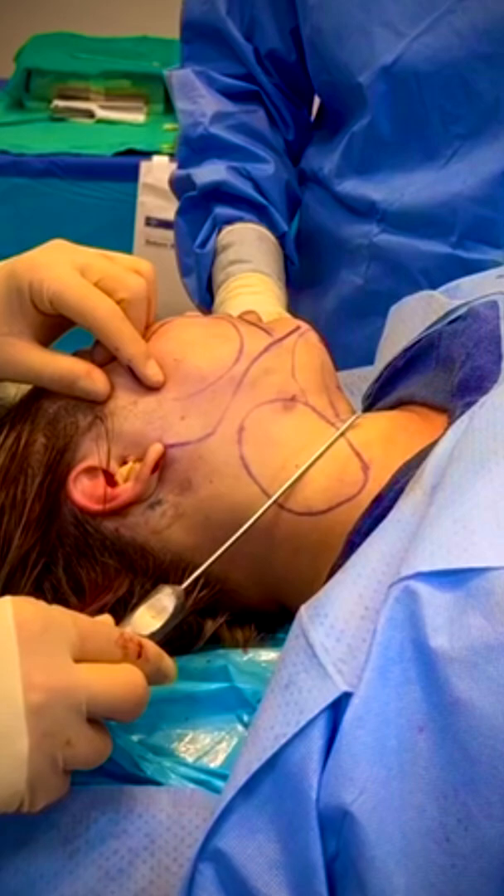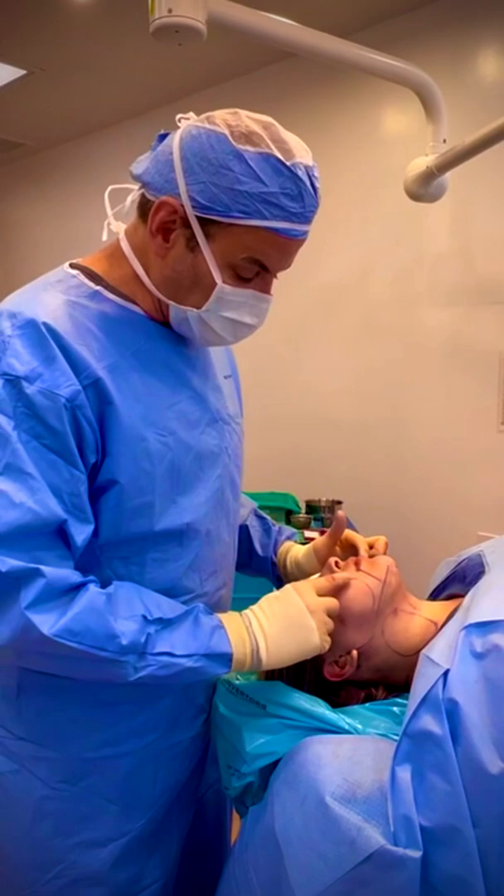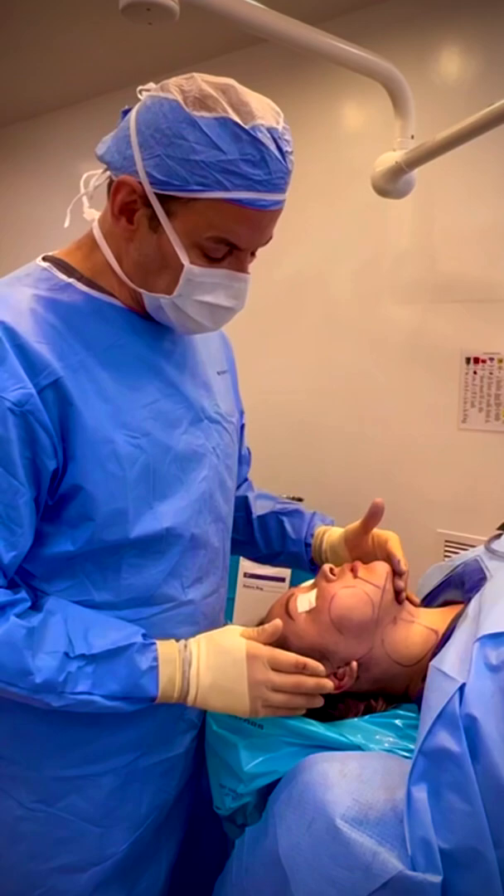She had a little bit of fullness underneath her chin, so we're going to really concentrate on that area as well. We just insert it in one of our little punctures by the ear — you can see I'm just right underneath the skin going right around the jawline. Very painless. Once we get all the local in, the patients just feel pushing and pulling and they hear the noises, but they don't feel pain. We'll do this side and then the other side and then we'll be ready to do MyElevate. We removed some little fat deposits underneath the chin as well as all the way around the angle of the jaw.